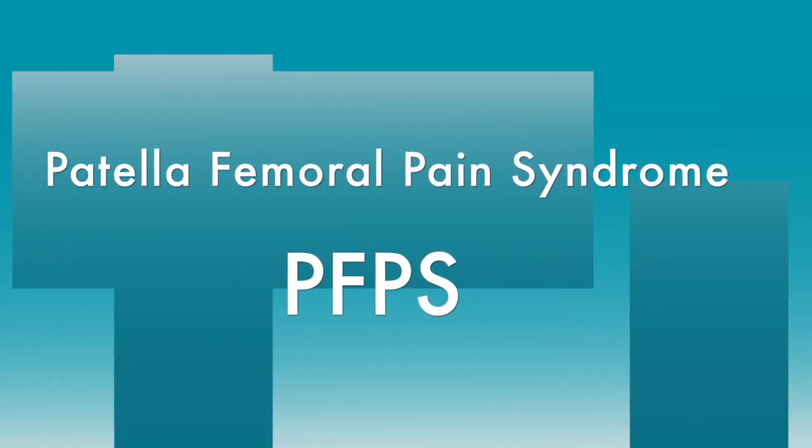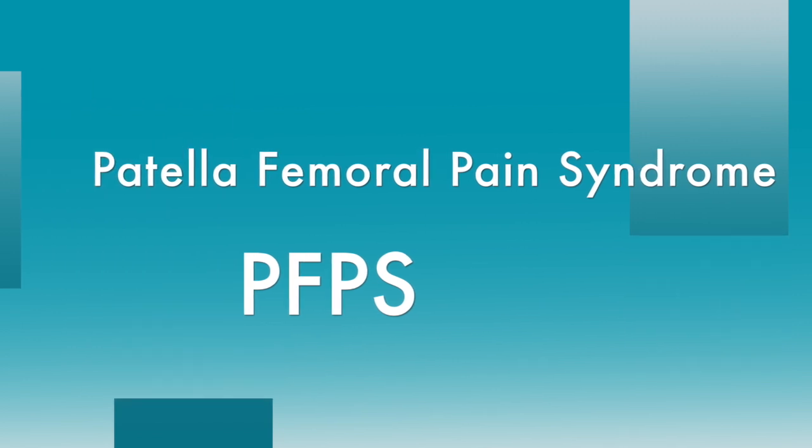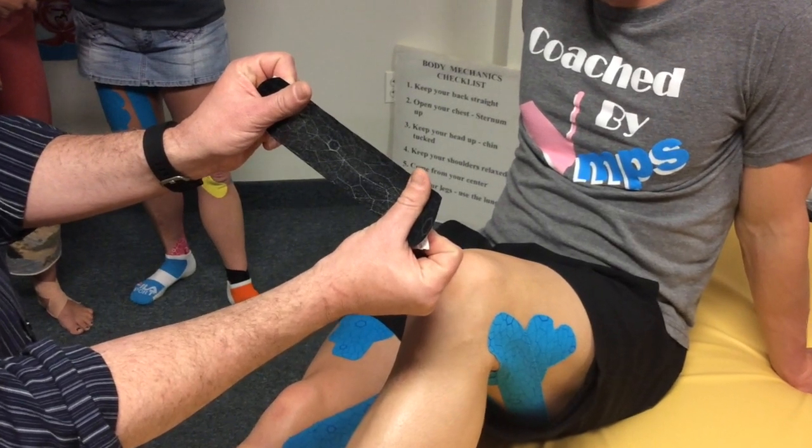The next application we'll demonstrate is for a common condition known as PFPS or Patellofemoral Pain Syndrome. We will start by placing the patient's knee in approximately 30 degrees of knee flexion.